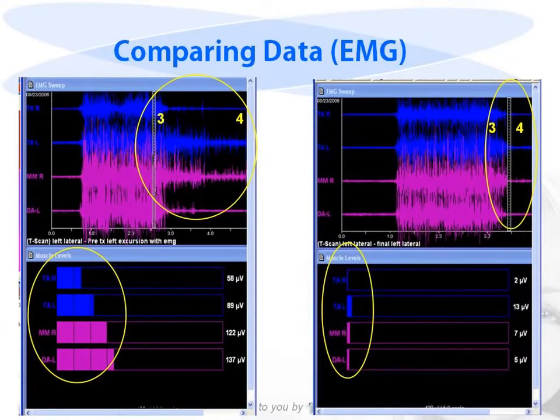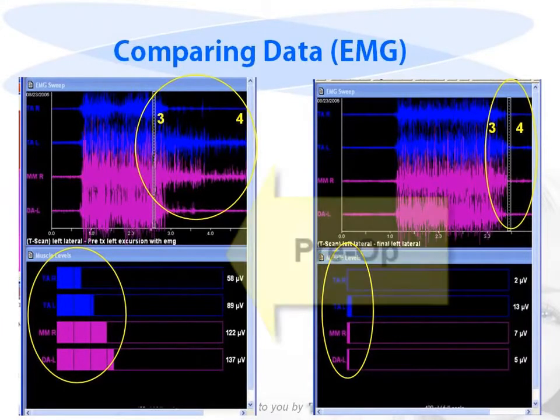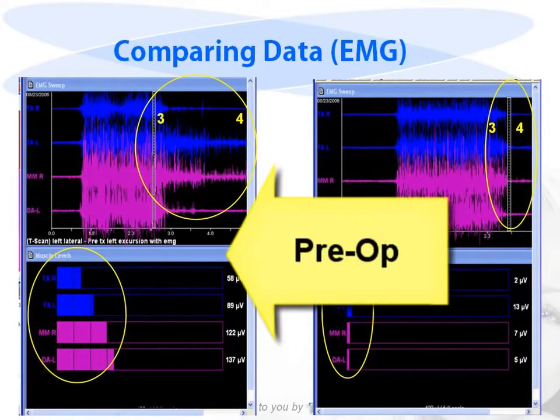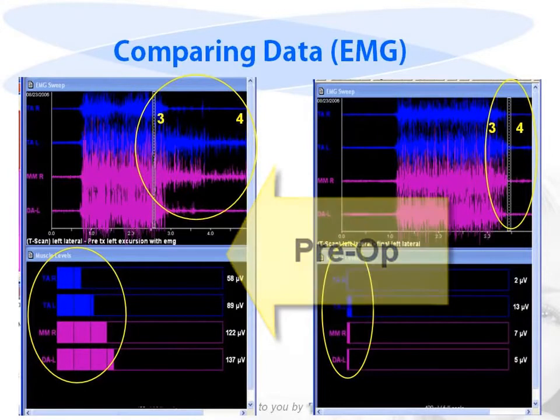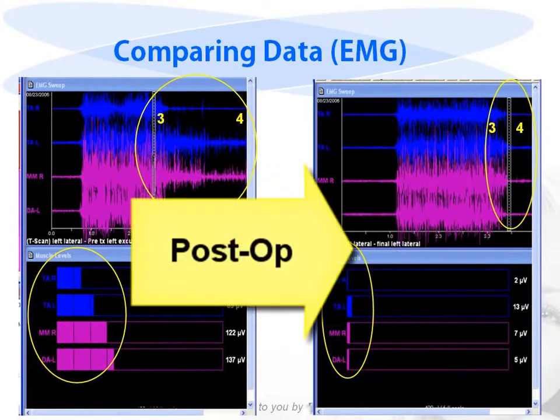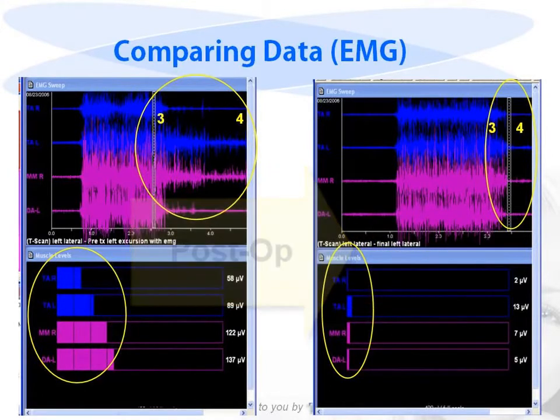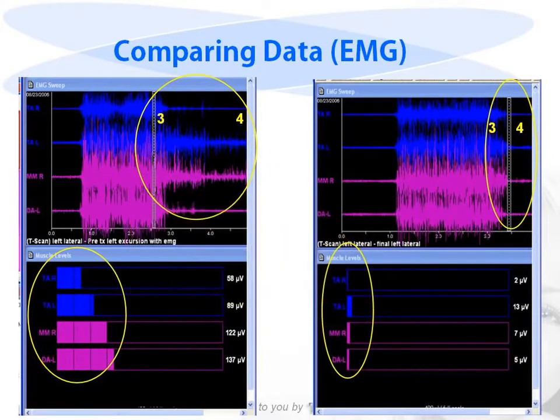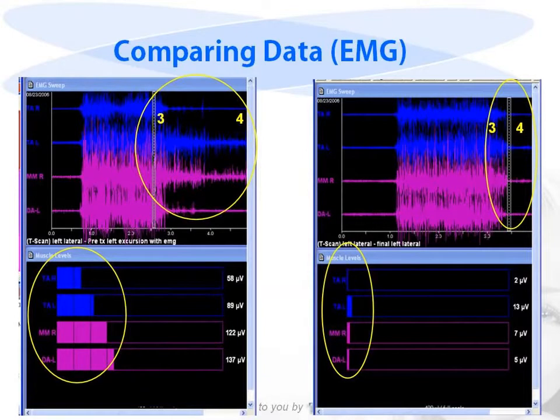A comparison of the pre-op to the post-op condition with long disclusion time pre-operatively versus short disclusion time post-operatively, you can see the dramatic difference between the time it took to go from the commencement of the excursive movement, number 3, to anterior guidance, number 4.